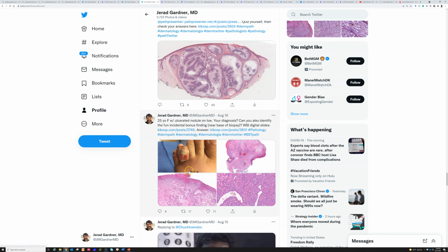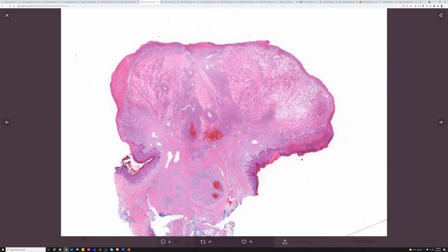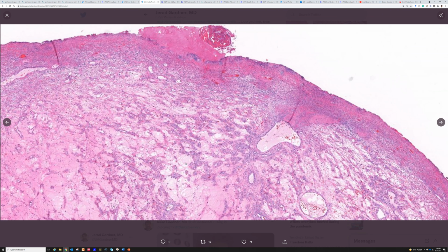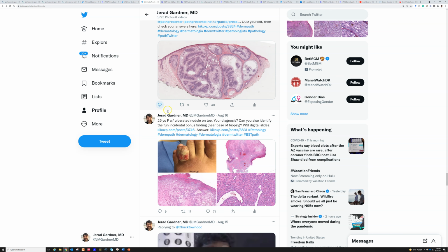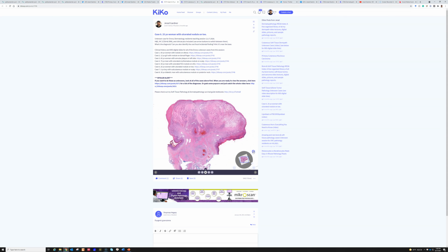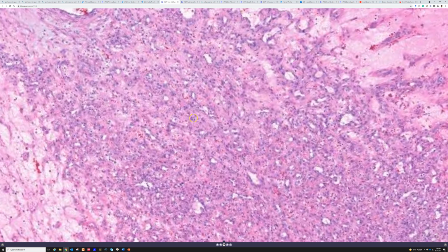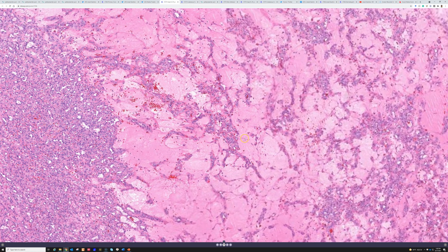So that way people can look at this and go through the pictures and think, this is a big polypoid thing, it's got vessels in it, but the quality of these photos isn't as great, maybe let me go look at the digital slide. So they click the link and pull up the digital slide here. Then they can zoom in and really explore the whole slide in nice detail and see everything.